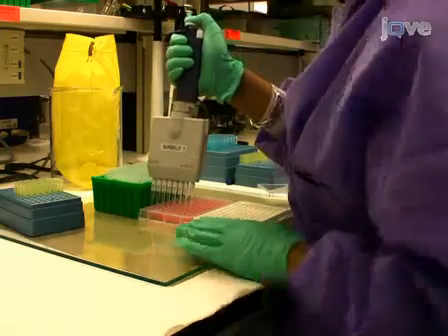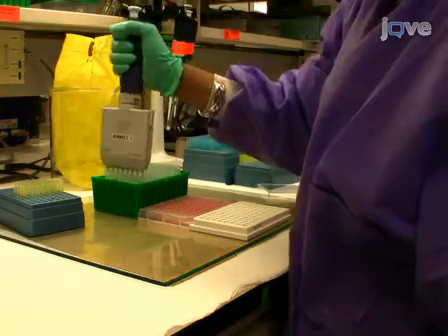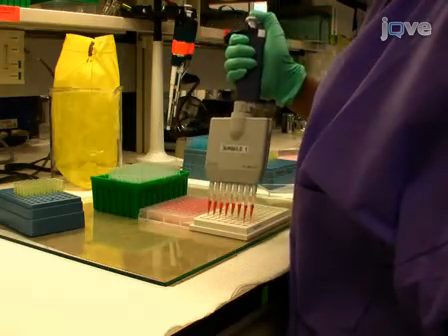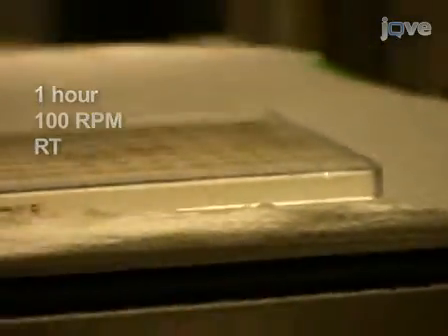After the 1-hour plate incubation, transfer the 100 µL of Ruc antigen-antibody reaction mixture to 96-well filter HTS plates containing the protein A/G beads using an 8-channel micropipette. Incubate the 96-well filter plate on a rotary shaker for 1 additional hour at 100 rpm at room temperature.